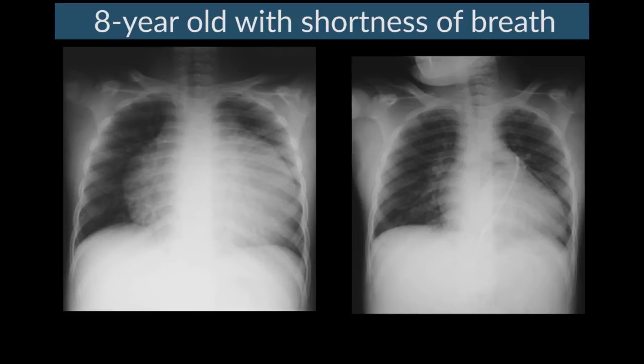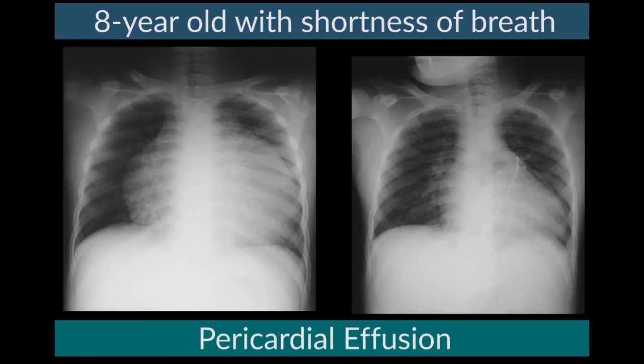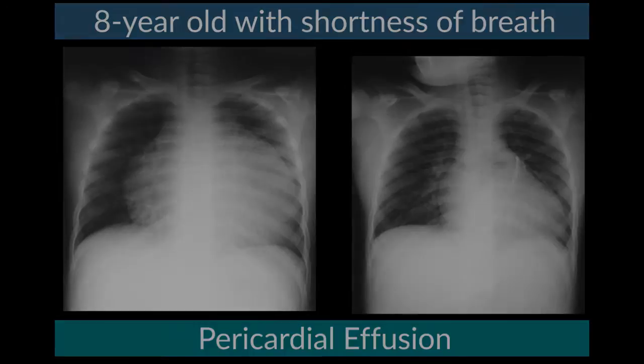Here, the same child is shown after a drainage catheter has been put in the pericardium, and you can see a marked difference in the size of the heart.